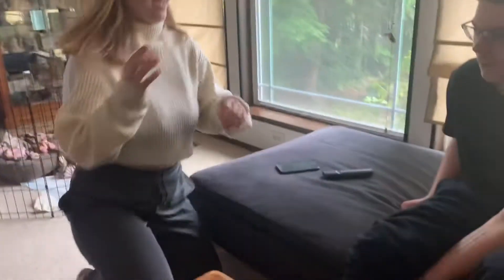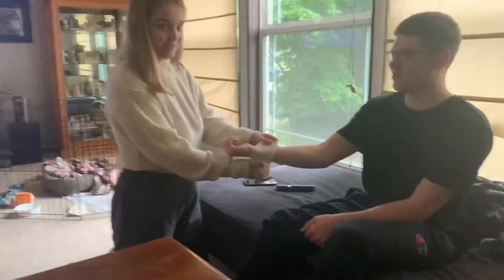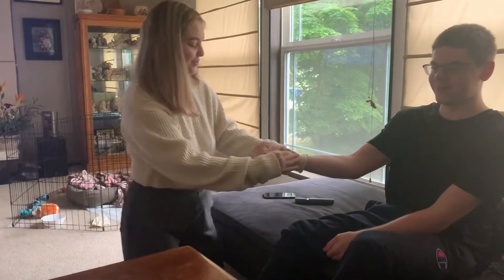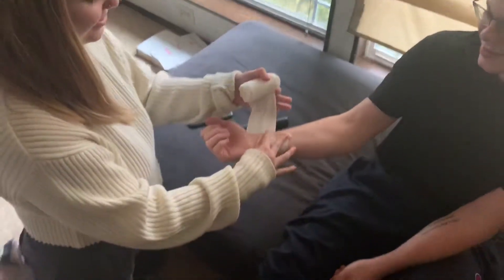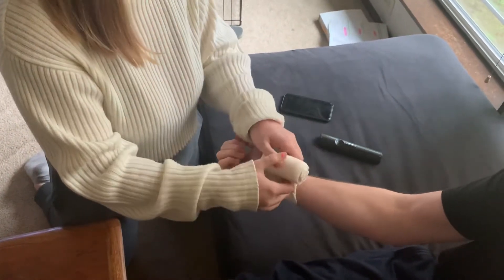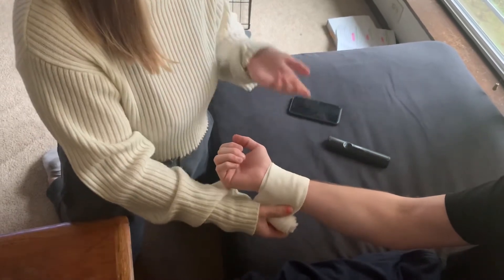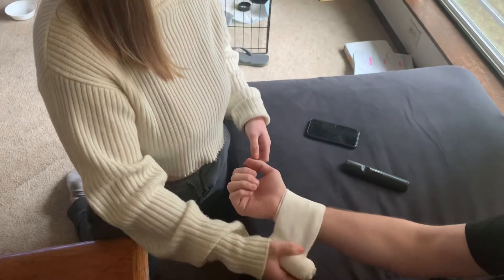I'm going to start with a corner, wrap it, and then pull the corner down and wrap it again — and that is a circular turn.